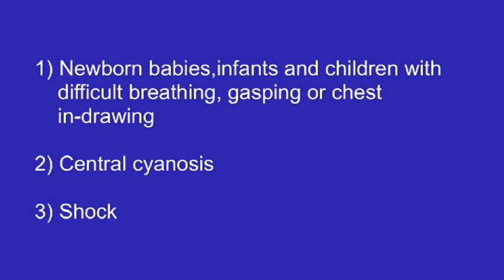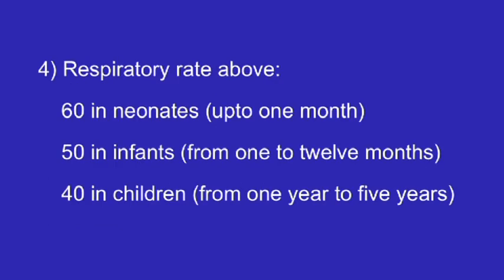Indications: newborn babies, infants and children with difficult breathing, gasping or chest indrawing. Central cyanosis, shock. Respiratory rate above 60 in neonates up to 1 month, 50 in infants from 1 to 12 months, 40 in children from 1 year to 5 years.